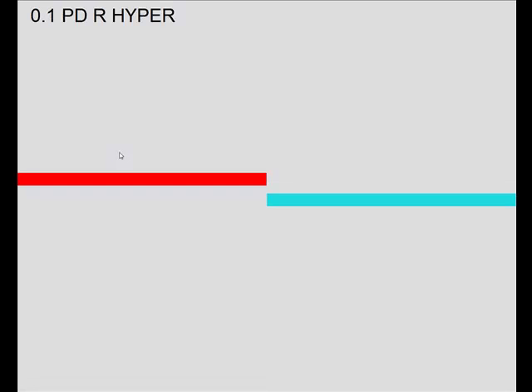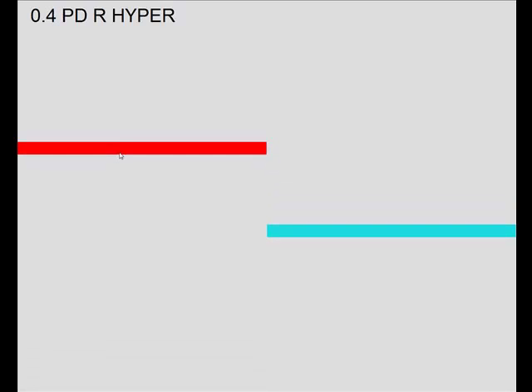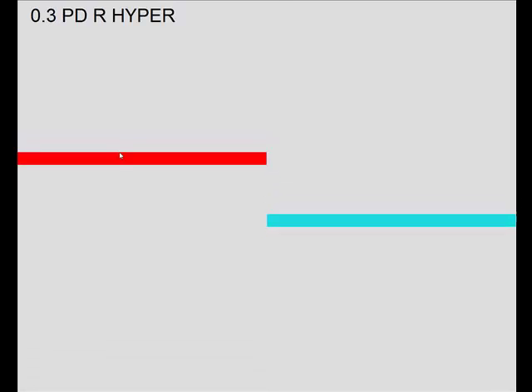That's for measuring vertical phoria. And then we've got an associated phoria test there where the patient wears red and green visors. One eye sees the bar at the top, the other eye sees the bar at the bottom. They simply line them up. Then you can measure the phoria, the horizontal phoria in this case, and vertical phoria in this case.